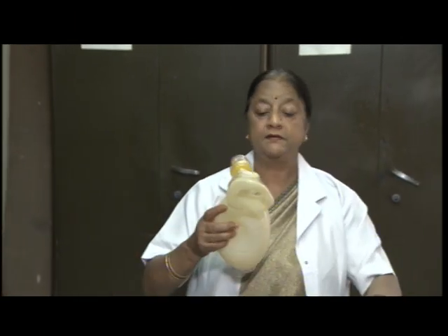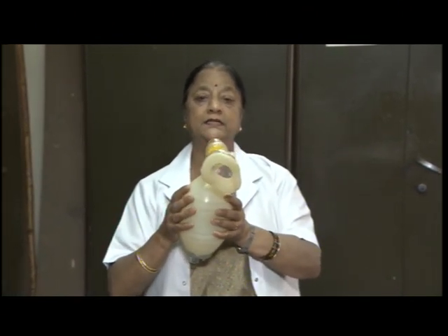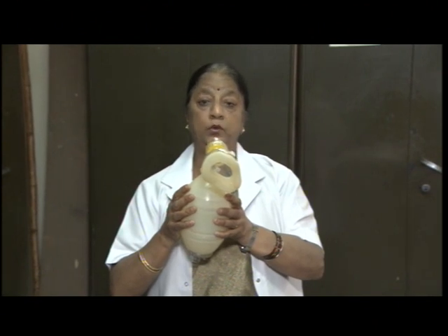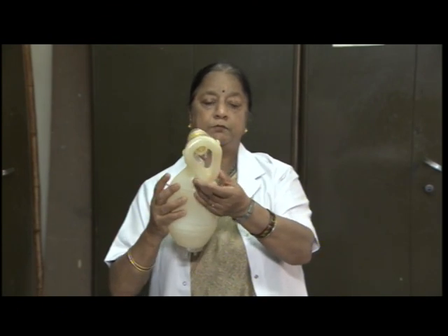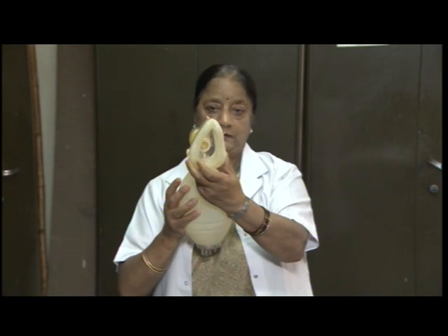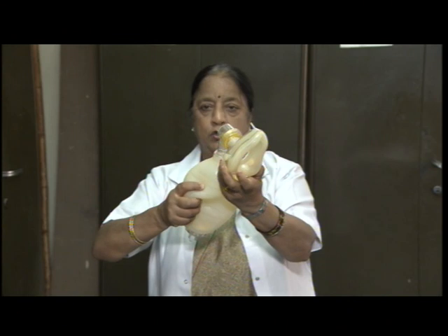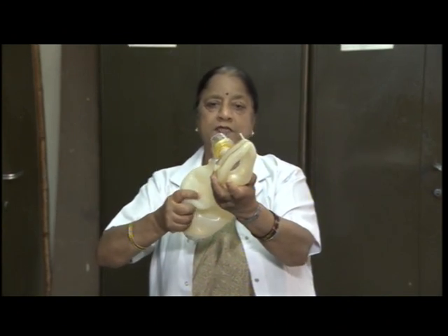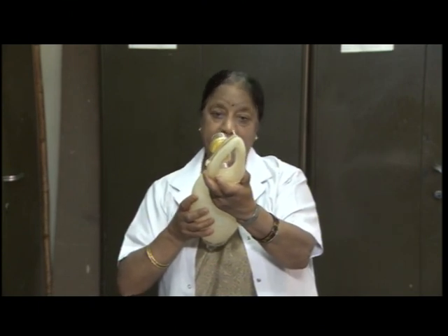Then sometimes the patients have problem in breathing. We make use of certain things. This instrument is called AMBU bag, AMBU, artificial mechanical breathing unit. So, this is placed on the patient's nose, and then this bulb is compressed to give the patient the definite volume of air inside the lungs for taking care of the breathing.